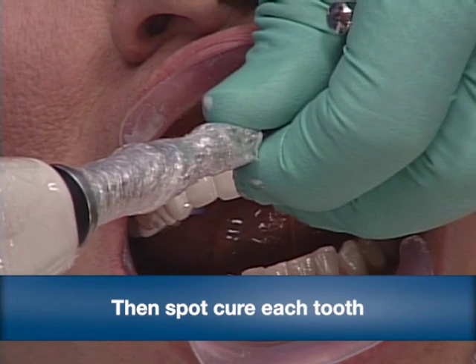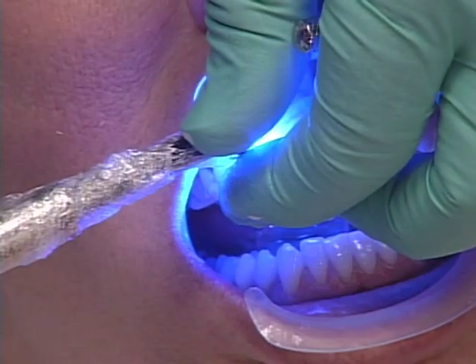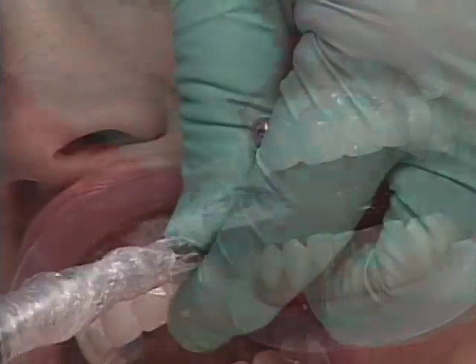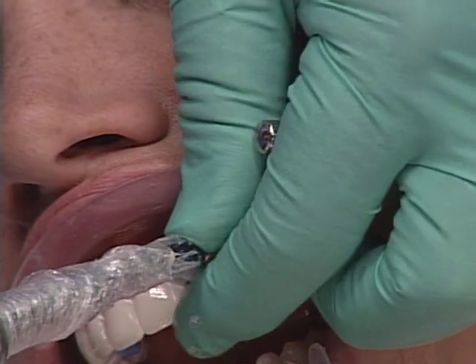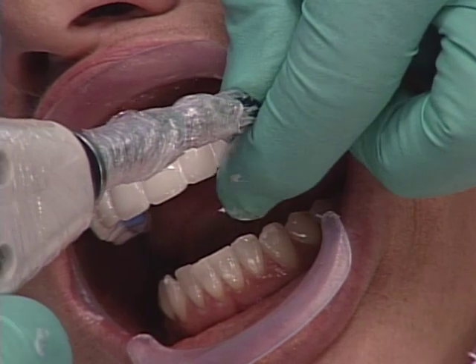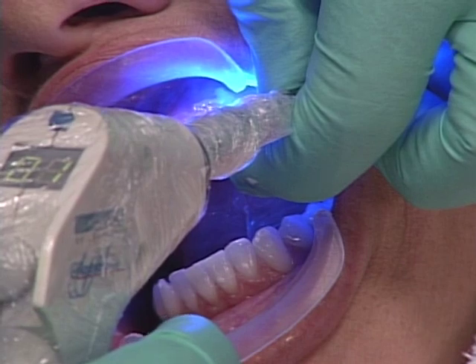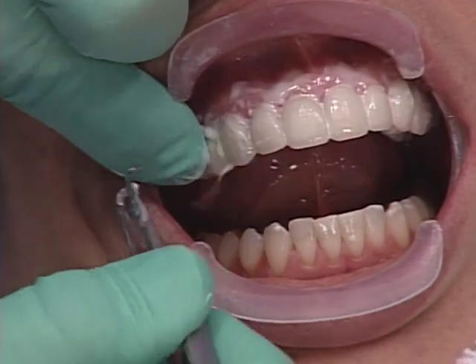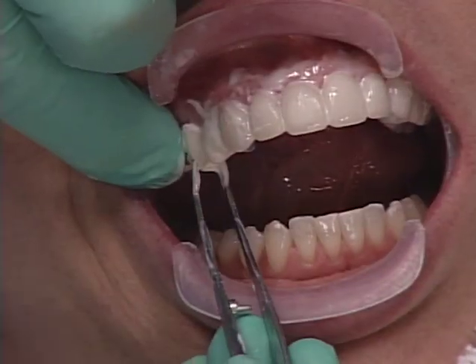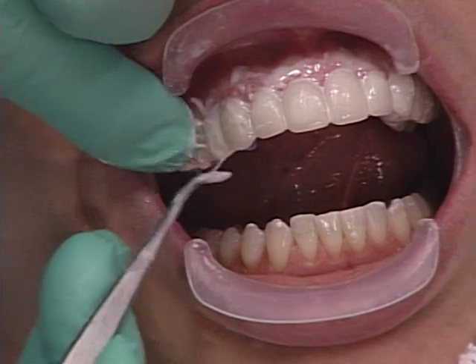And close your eyes for 1 second. Put it in the center part of the tooth. Close your eyes. Now remember, I put this cuspid in here, but I'm not going to touch that cuspid because I don't want to have that contact get polymerized inadvertently. Close your eyes. Okay, now we got to get over here. These seat very nicely if you're putting the resin in and it just flows.